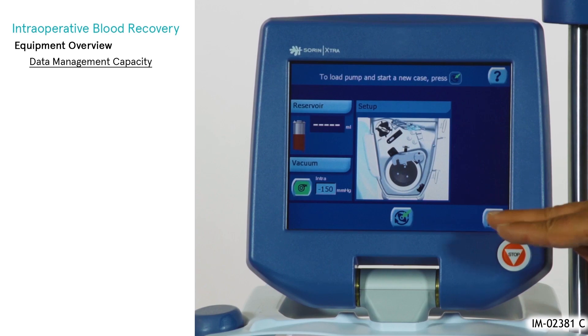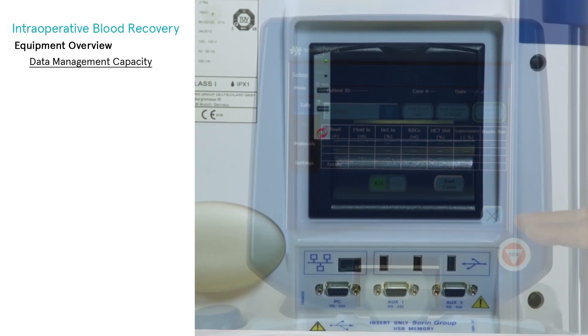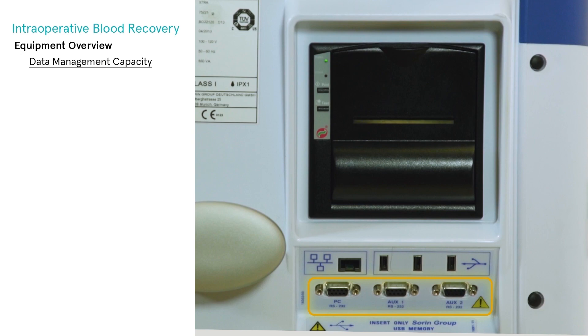The Extra data download option enables the operator to import processing counts and information for blood recovery and preoperative sequestration procedures in several ways: an integrated printer module, USB ports, and RS-232 serial ports that allow one to connect to most computers and computing devices.